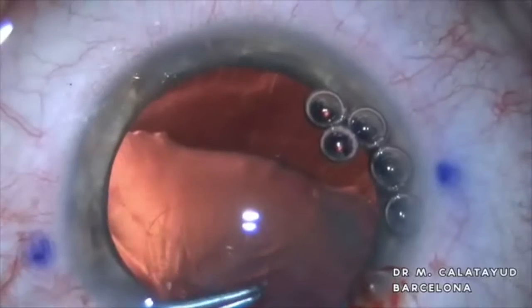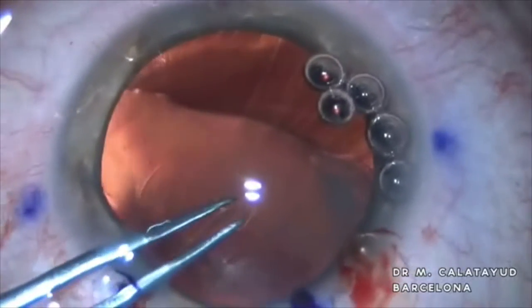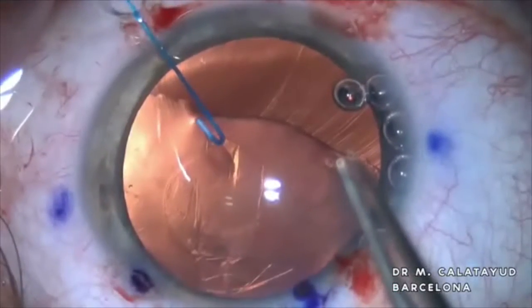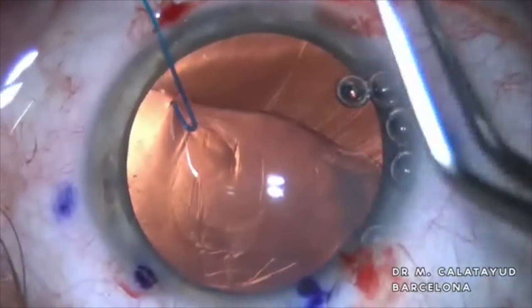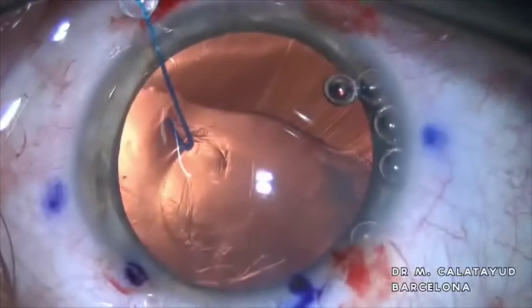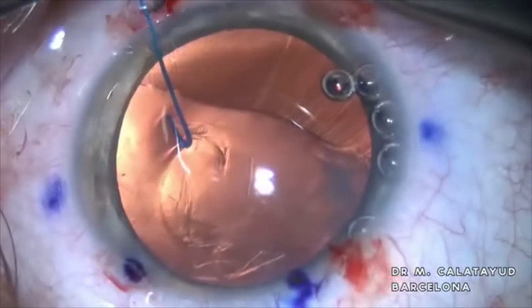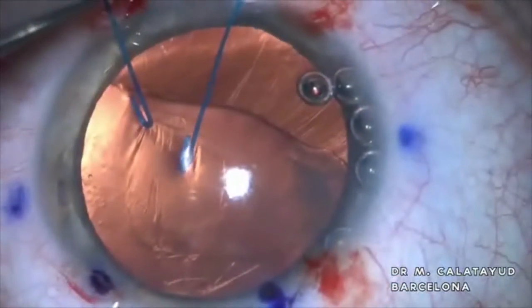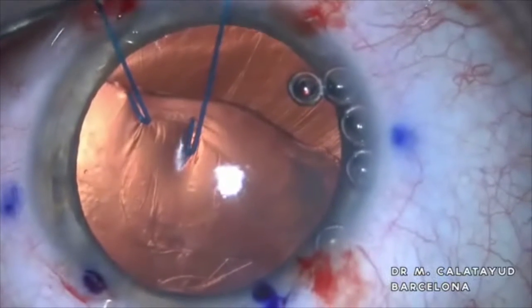Young people usually have a very elastic anterior capsule, so we should start with a cystitome and then pull the tissue to the center of the crystalline with a capsulorhexis forceps. We can use the iris hooks to help us position the crystalline back and stabilize it while we finish our rhexis.